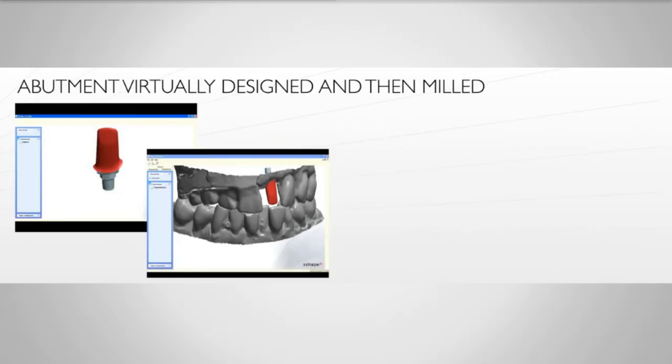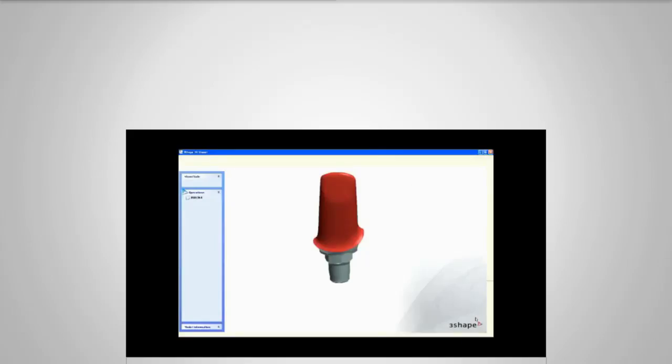All our abutments are virtually designed. So in Frank's case, this is done using 3Shape. And you can actually look at these files yourself. You'd have to pay for the design software, but for the observation software, you don't have to pay for it. You can look at the design of your abutment if you want to approve that before the lab has it milled.